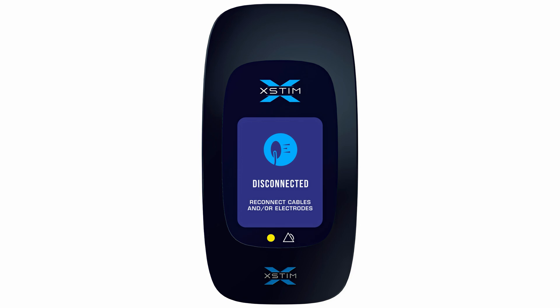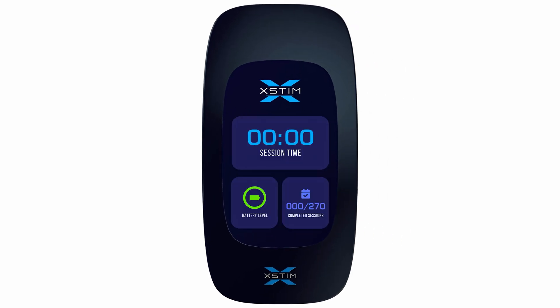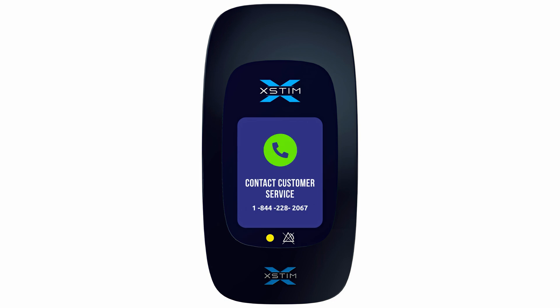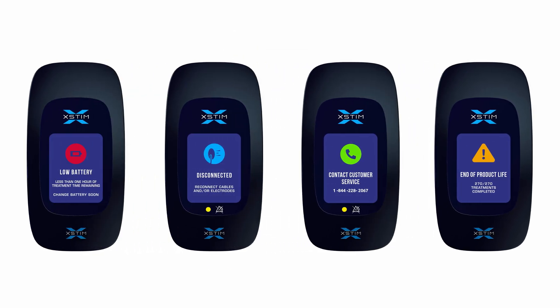If the disconnected electrodes or wires notification screen is illuminated, treatment is not being provided and X-Stim notifications will be activated. If X-Stim senses a change in the state of normal operation, the relevant display message along with an audible beeping indicator and vibration indicator will automatically activate to provide information.